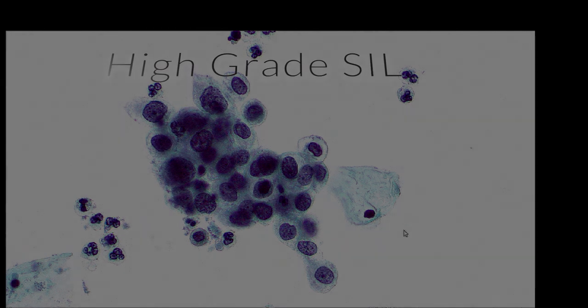Hi, it's Paul. In this clip we're going to look at high-grade SIL. And first of all, we'll start with the histo.